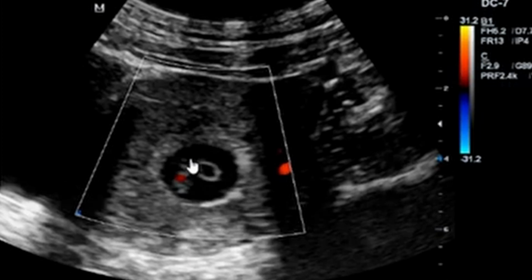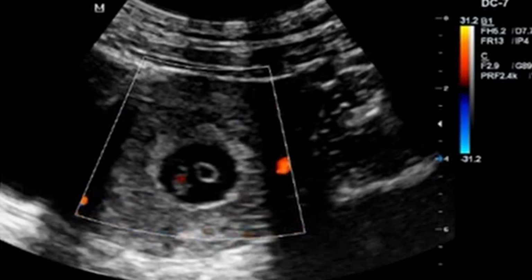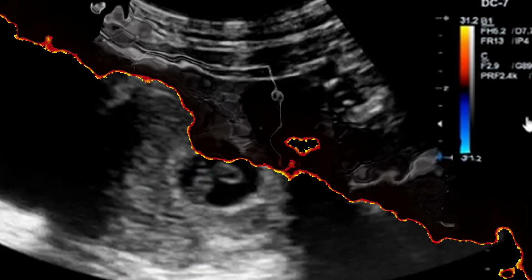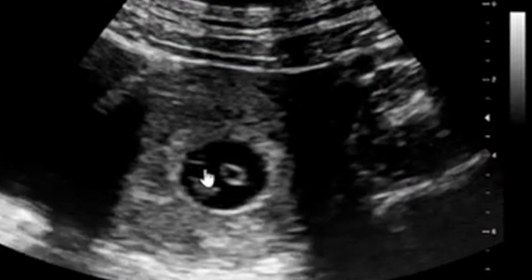In the event that we are not going to see this fetal movement, heart movement, we are going to call this a missed abortion. So once again, you can appreciate the yolk sac that we have here. That's the yolk sac. Again, you can appreciate it from this end.